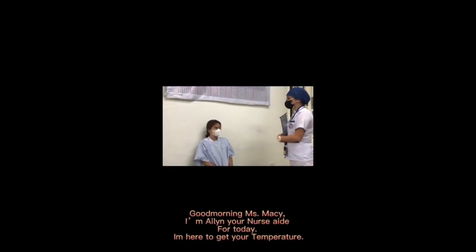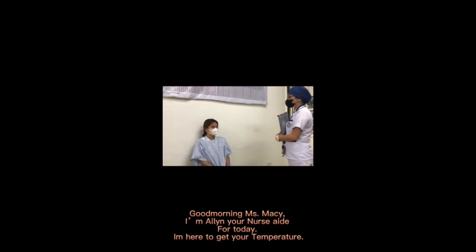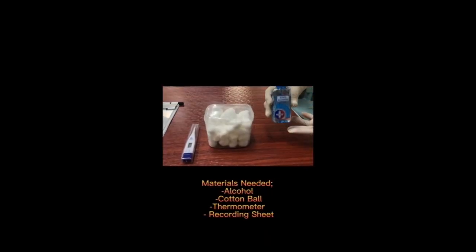Good morning Miss Macy, I'm Eileen, your nurse aide for today. I'm here to get your temperature. For the following materials to measure temperature, we will go over what is needed.